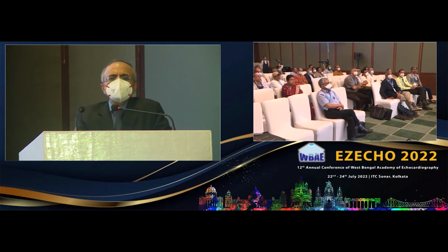So a footballer is like an intermittent burst of activity, the highest level of physical fitness. There generally the LVs will be larger. So any LV dimension rise will tell me that this is not HCM, but this thing. So there are so many factors you can put together. And again, look at the Holter also for arrhythmias and so on and so forth.